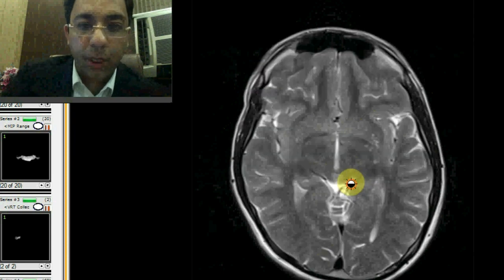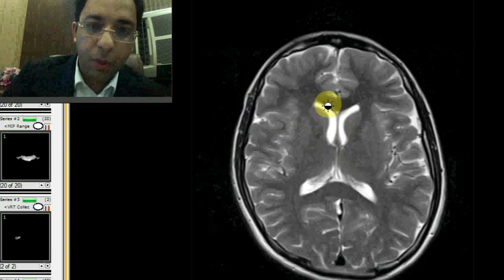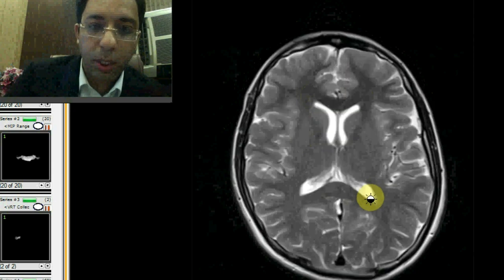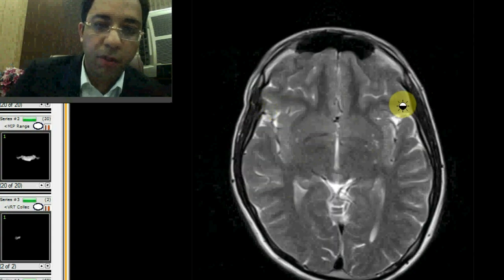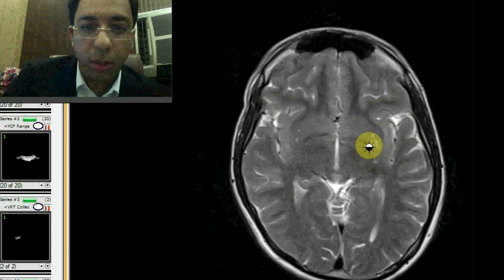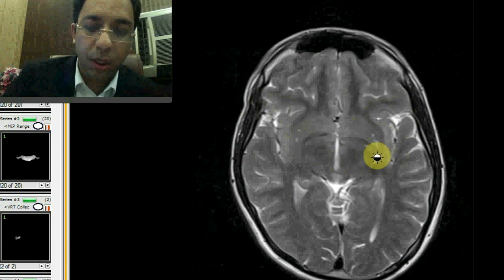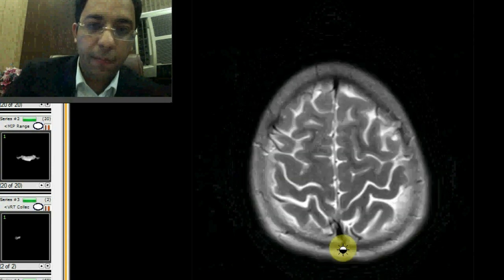As I go up, you can see the head of the caudate nucleus. Going further up, you can see the interventricular septum — the septum pellucidum — and the posterior part of the corpus callosum. This is the thalamus. You can see the anterior horn of the internal capsule, the genu, the posterior horn, the putamen, and medially the globus pallidus. The sylvian fissure is well seen here, as is the insular cortex. A few white dots represent perivascular spaces, which are normally seen on MRI brain.